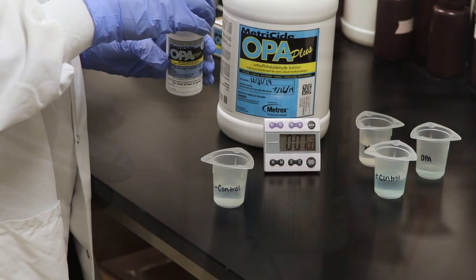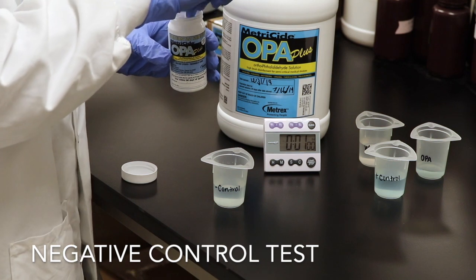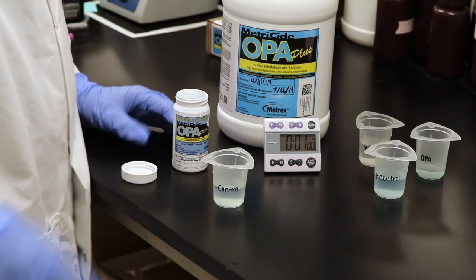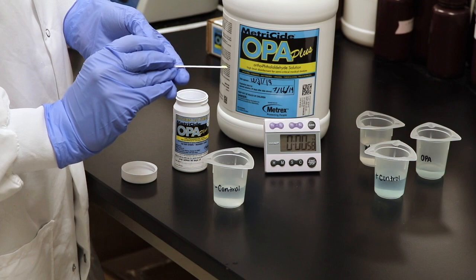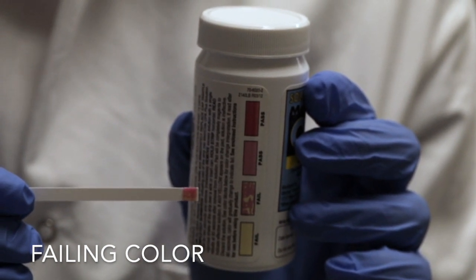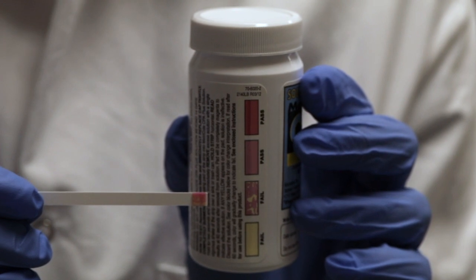Perform the negative control test by taking one Metricide OPA Plus test strip and dipping it in the negative control solution for two seconds. After two seconds, remove the test strip and shake vigorously once. Then hold horizontally for one minute. After one minute has elapsed, read the test strip against the Metricide OPA Plus test strip bottle. The strip should indicate a failing color of either bright yellow or magenta with yellow spots.